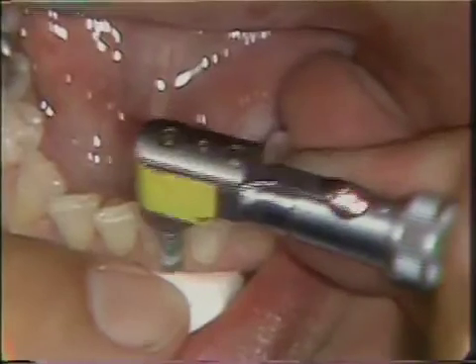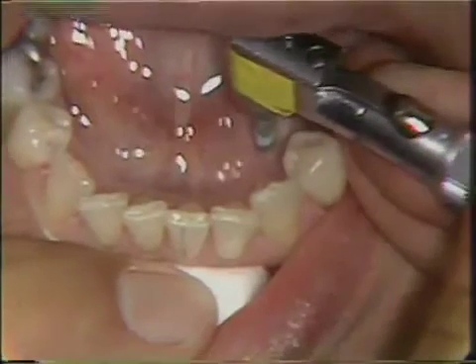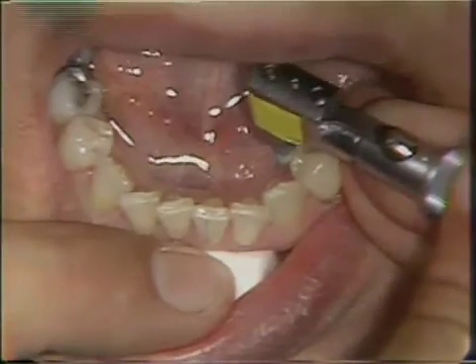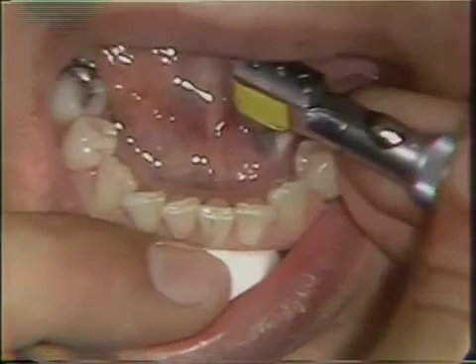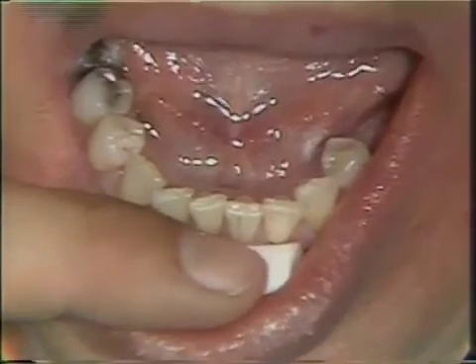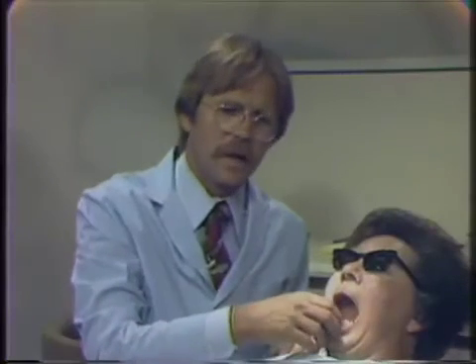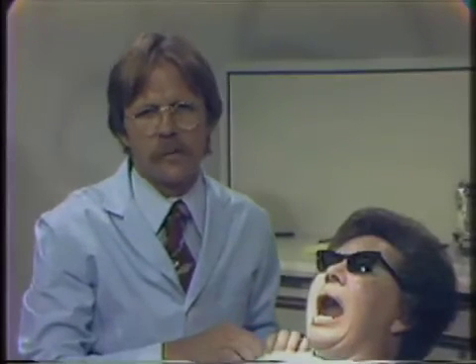Now I've done this already on my study cast, so I have an idea as to how much reduction is going to be necessary. This surface would also be polished with a similar shaped stone of a different grit before we would accept it finally. However, we want to double check now to see if the parallel-shaped surface that we have just created in the patient's mouth is parallel to the given path of insertion.